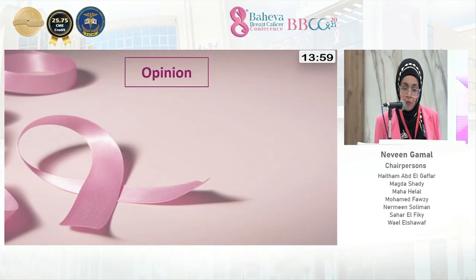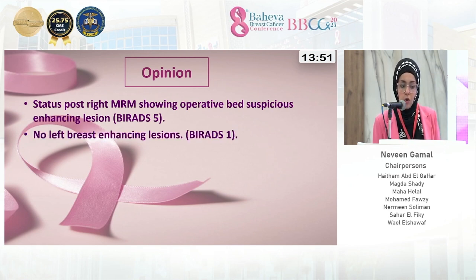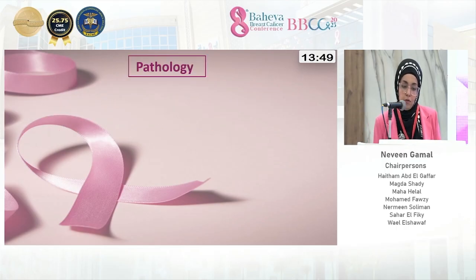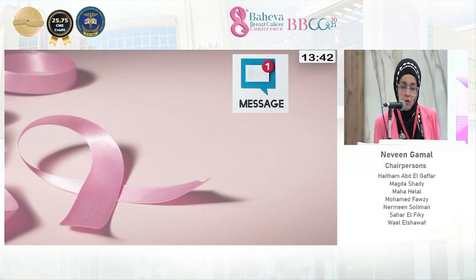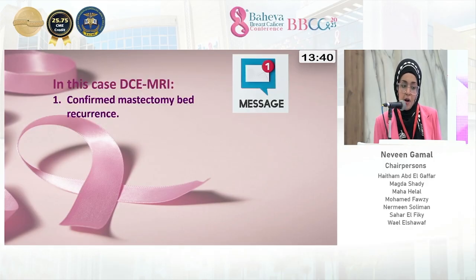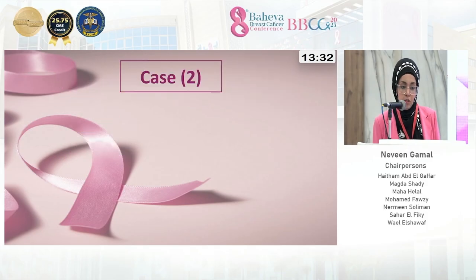node. So our opinion in this case was a status post right MRM showing operative bed suspicious enhancing lesion, BI-RADS 5, with no left breast enhancing lesions, BI-RADS 1. And the pathology report came with recurrent invasive ductal and lobular carcinoma grade 2. So in this case, MRI confirmed the mastectomy bed recurrence, detected the chest wall infiltration, and excluded contralateral lesions.